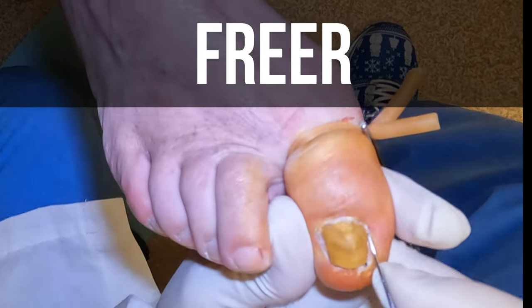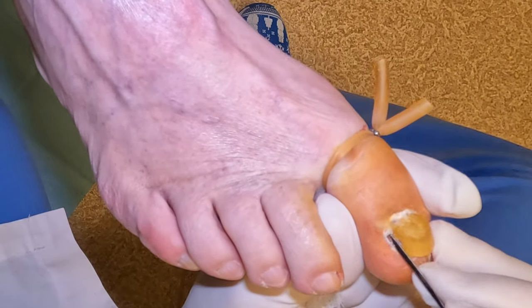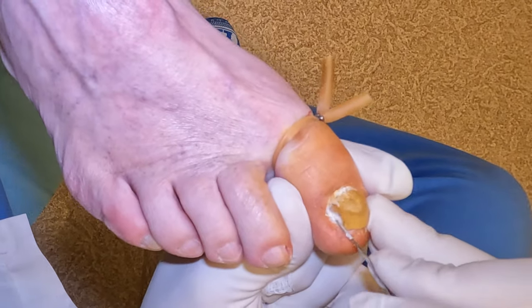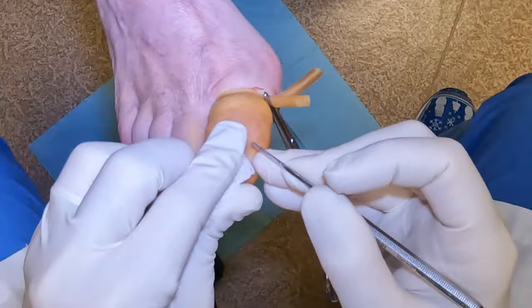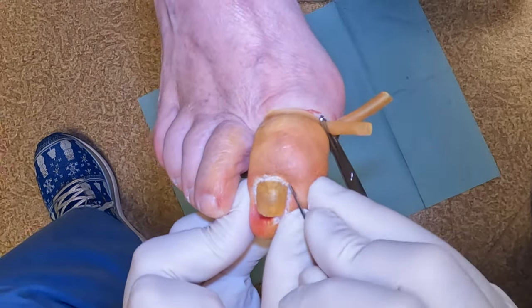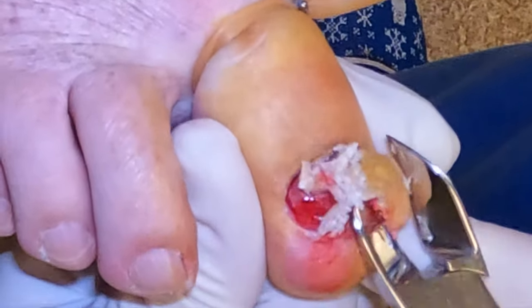We use a freer elevator to gently free away the skin or the cuticle area from the toenail that we're removing. Sometimes we go under the nail as well so that we can loosen it, and we get it all freed up from the skin edges with our freer. After we do that, it's time to remove the nail.